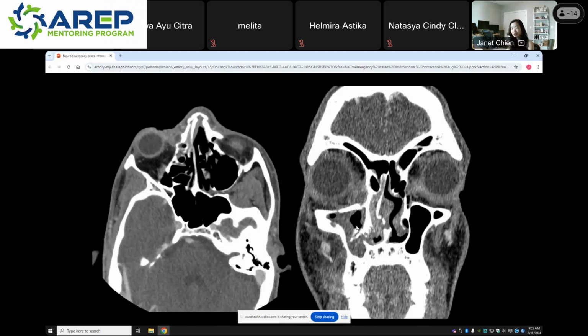Oops, sorry. It's here too. This is an interesting, not a common case, but that history is really good for this. Copious eye discharge.